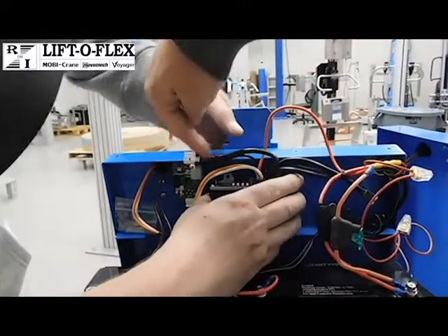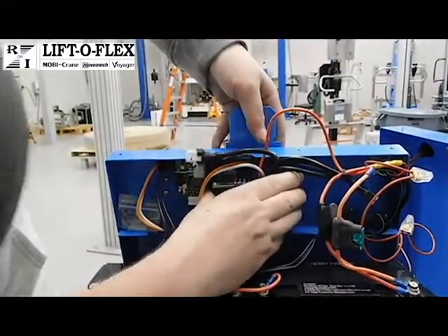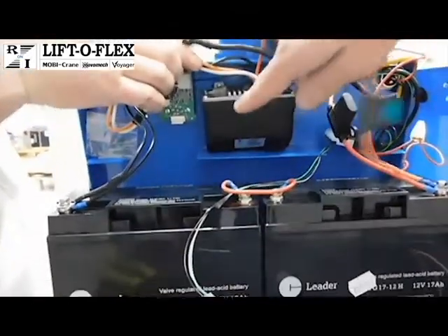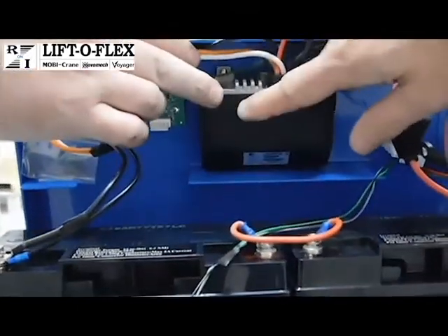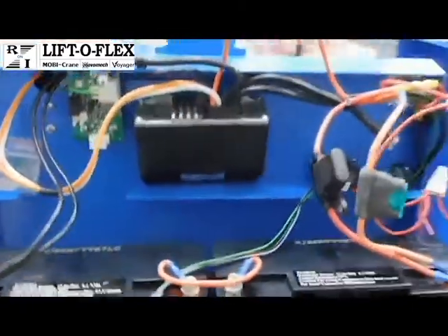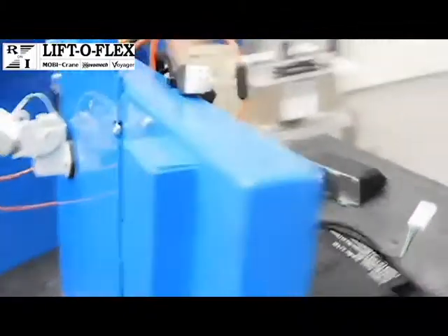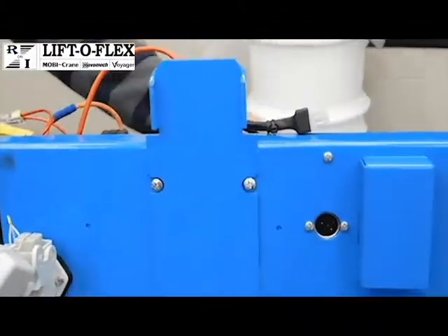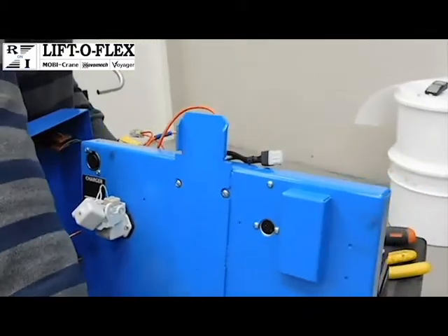He's just disconnected the connection to the interface board to give a clearer picture. So now the card's back onto the screws, and if we go around to the back of the power pack, you'll see the screws that we're accessing. And then we'll just re-secure it with the nuts.